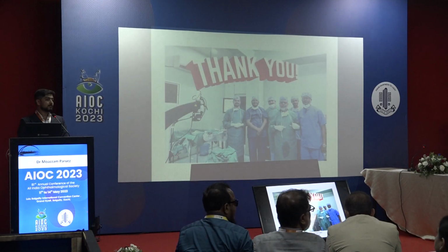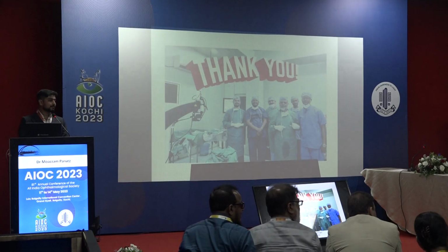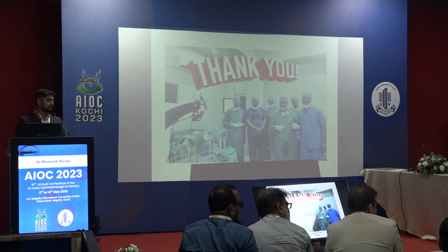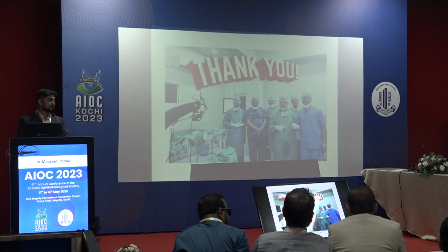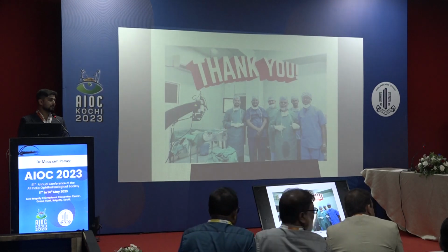Dr. Yasin sir, any input? I think removing OVD from the back of the lens is something very important, because otherwise there is a possibility of rotation of the lens. And as you said, we must ensure that the chamber postoperatively does not become shallow and again fluctuate. That is important.